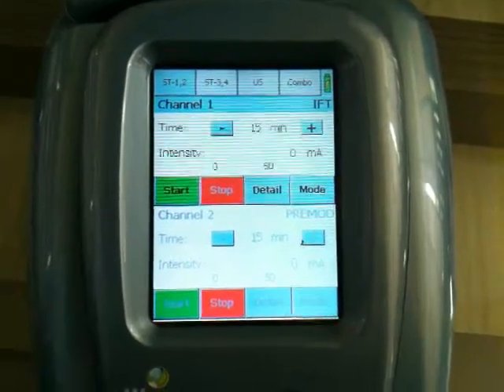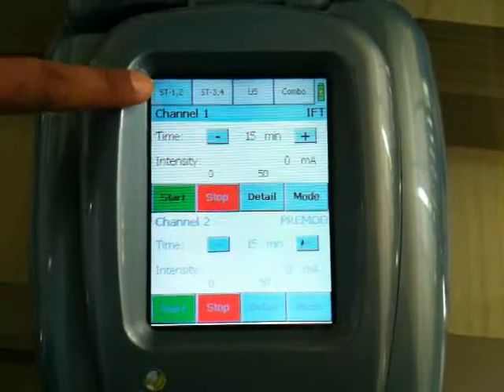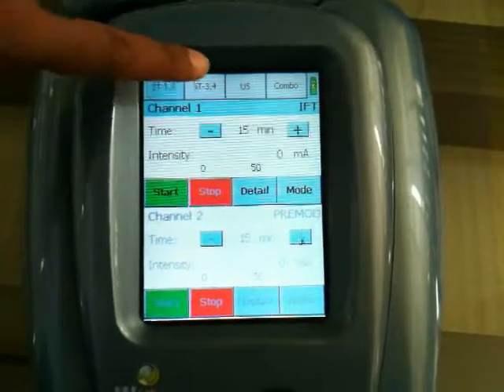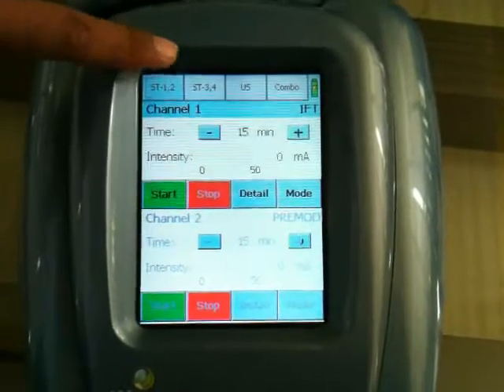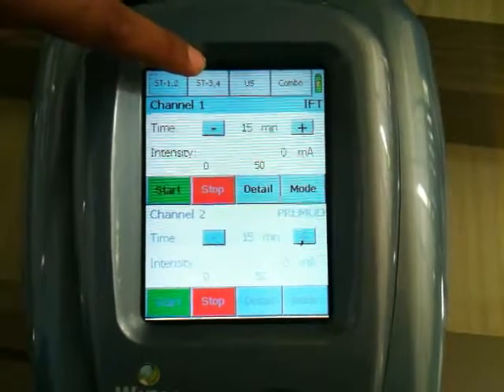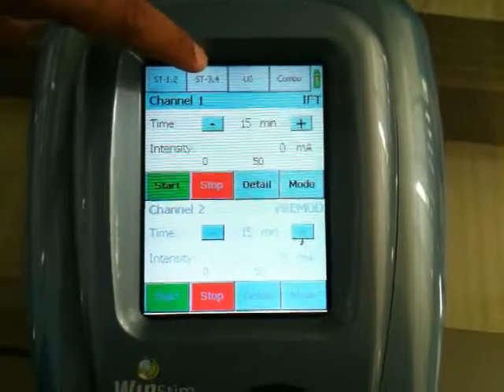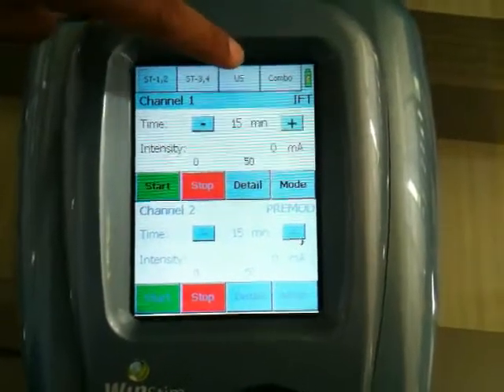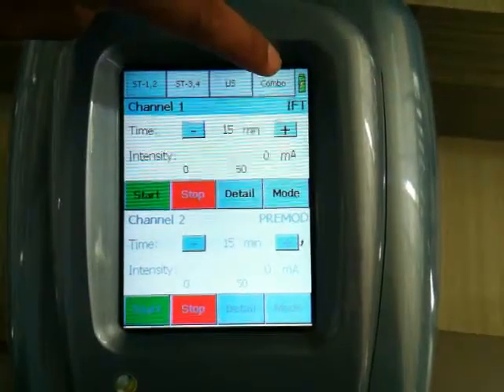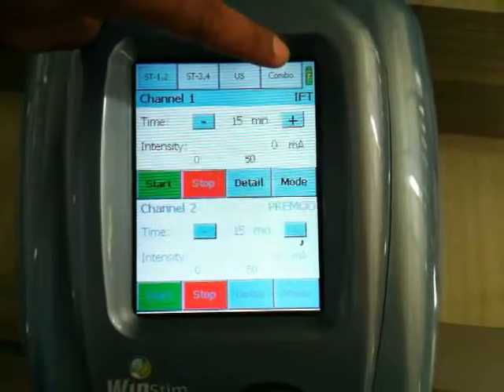After pressing default mode, the screen will appear. ST1 and 2 represent channel 1 and channel 2 for stimulation, and ST3 and 4 represent stimulation for channels 3 and 4. Thereafter, ultrasound and the combination of STIM channel with ultrasound.